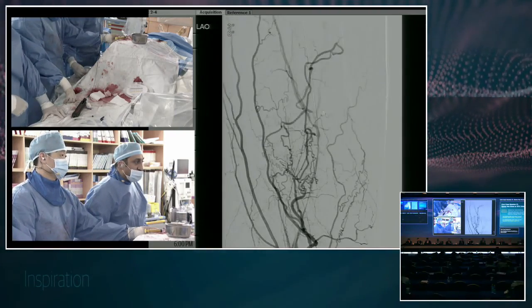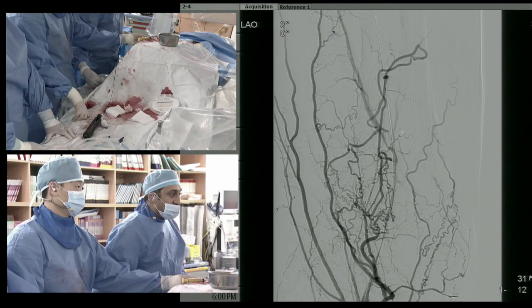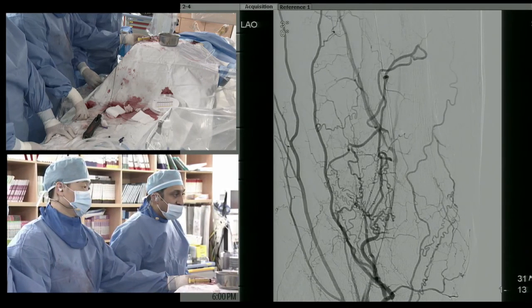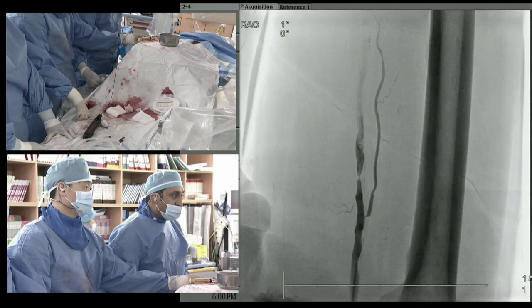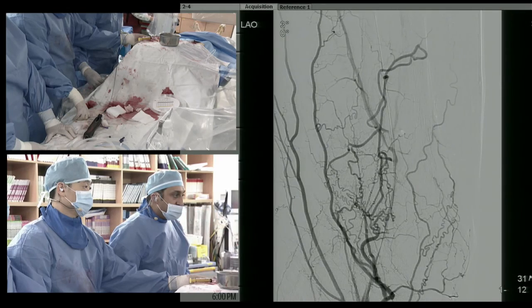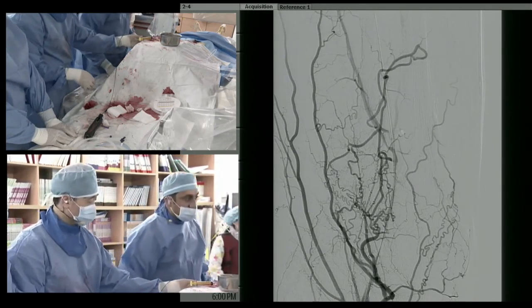I think we're good here. Is there a dissection proximal though in that popliteal? Yeah, exactly. Right here. So what you were saying is you stay away from that. You point your cutter away from that. We like to see from the P1 segment. Okay.